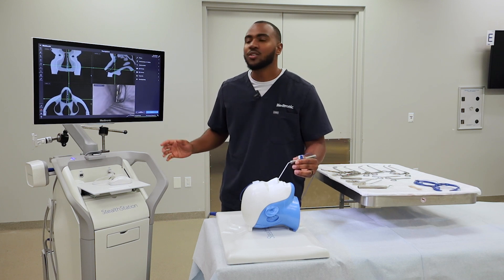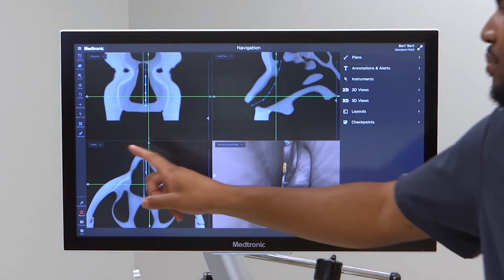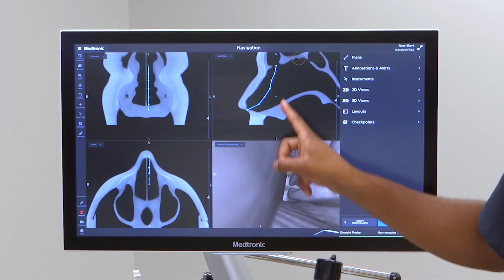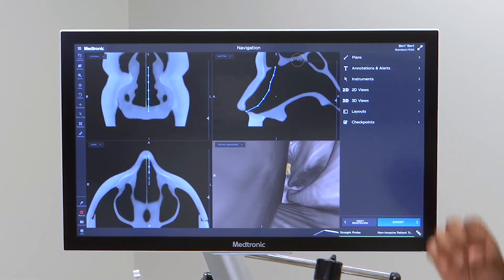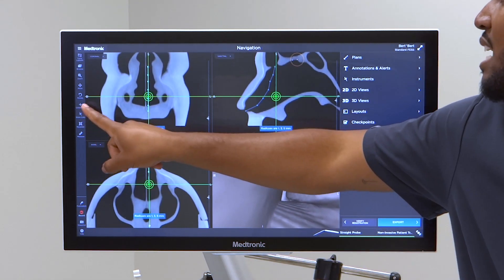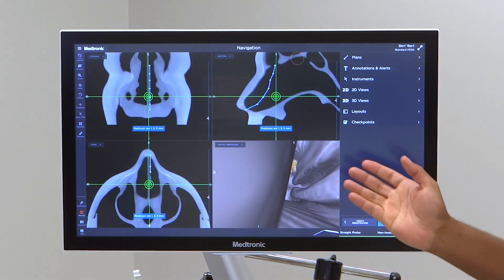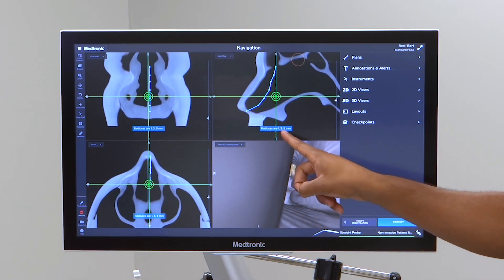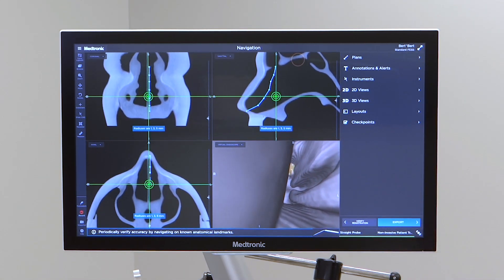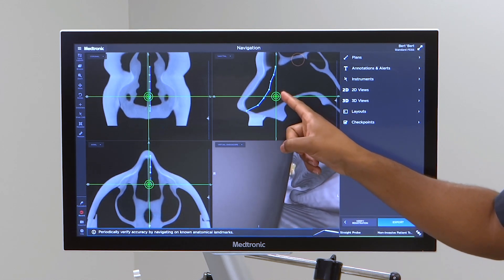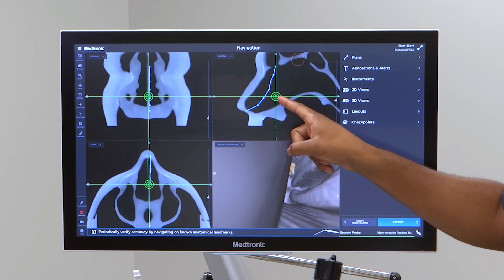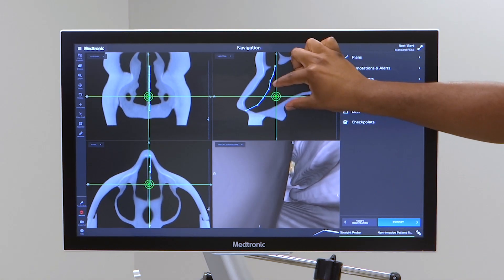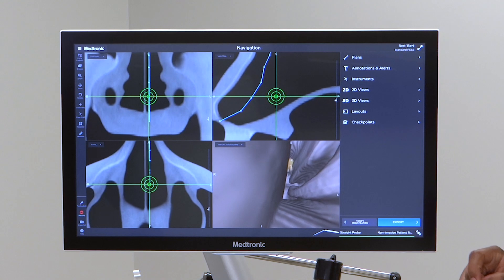One thing I'll point out also is you can play around with the different crosshairs — you can toggle those. Now I'm just on the dot feature. If you click crosshairs one more time, you can toggle to the target crosshairs. This message will pop up: radiuses are one, three, and five millimeters from the center, so it helps you gauge that unit of measurement.